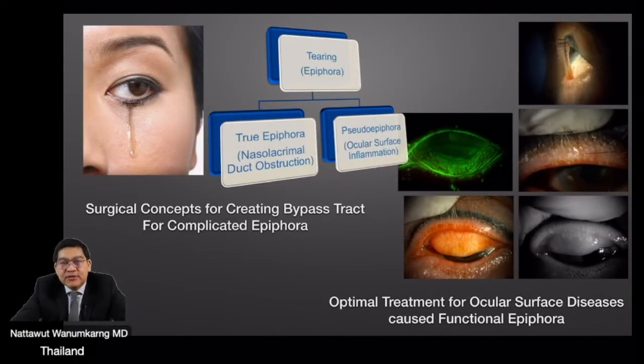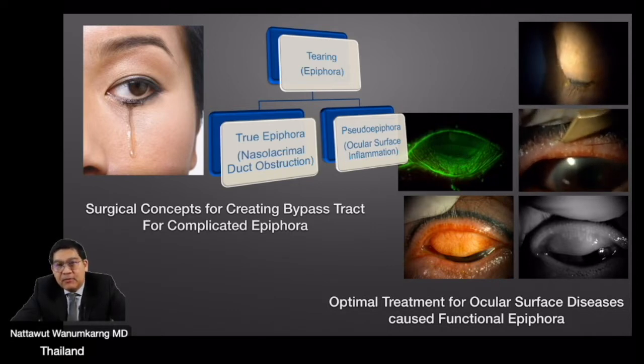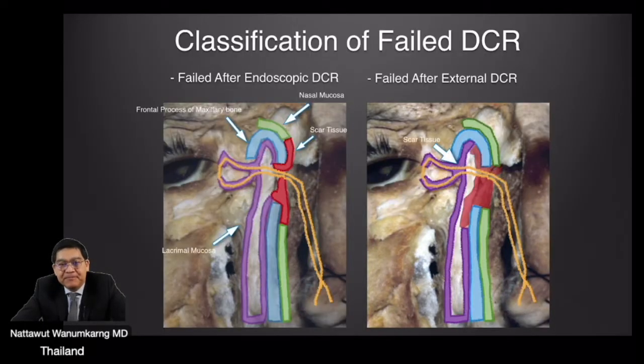For my current concept for approaching complicated tearing problems, the first part I would like to share is the surgical concept, and the second part is the concept of applying optimal treatment for severe ocular surface disease causing functional epiphora. On the right-hand side, we show my ideal lacrimal ostium.